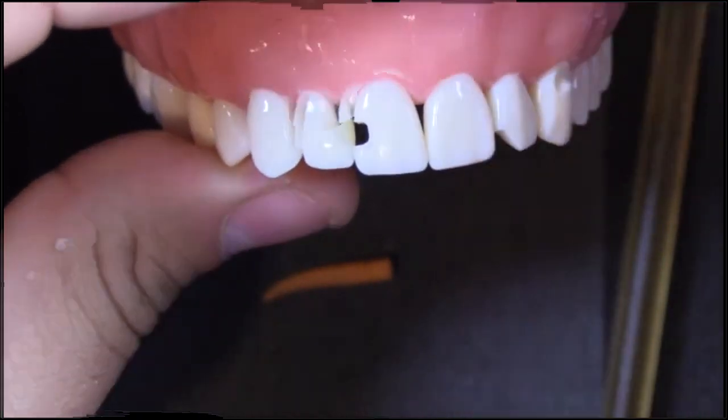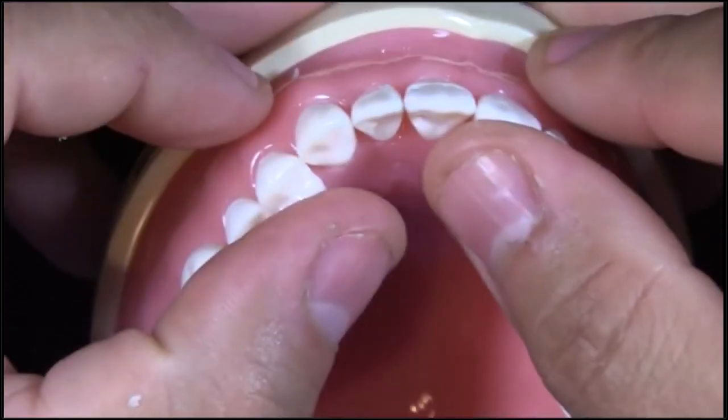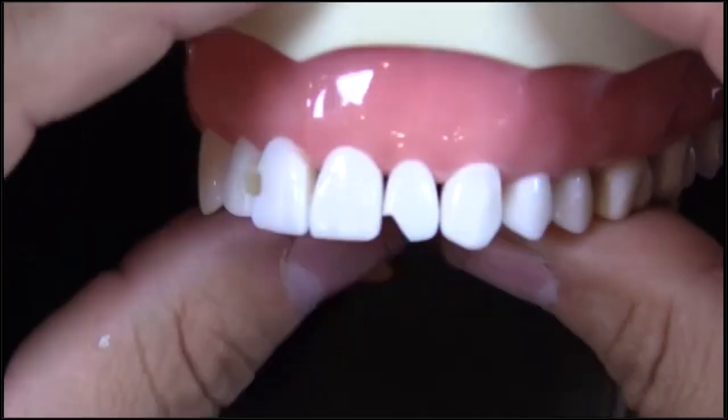Everything just comes out where I don't have to do a lot to the interproximal facial. I've got a little bit of excess right on the facial, but not on the interproximal surface. My line angle is set — that looks really good, I'm happy with that.